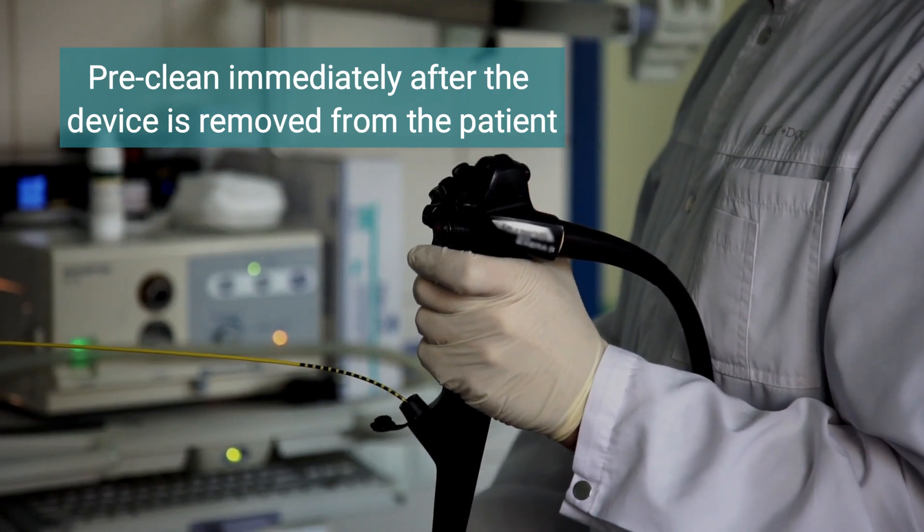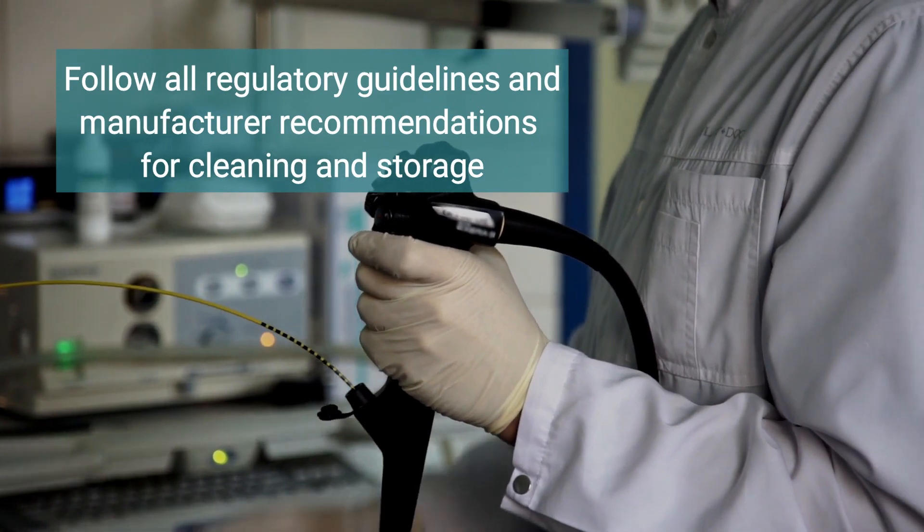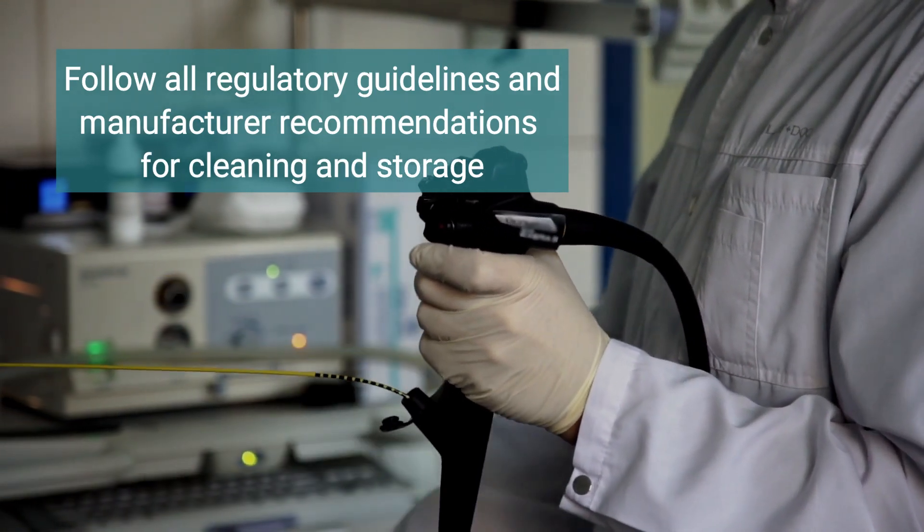Pre-cleaning should take place at the point of use immediately after the device is removed from the patient, to prevent dried soils and ensure best cleaning results and patient safety.